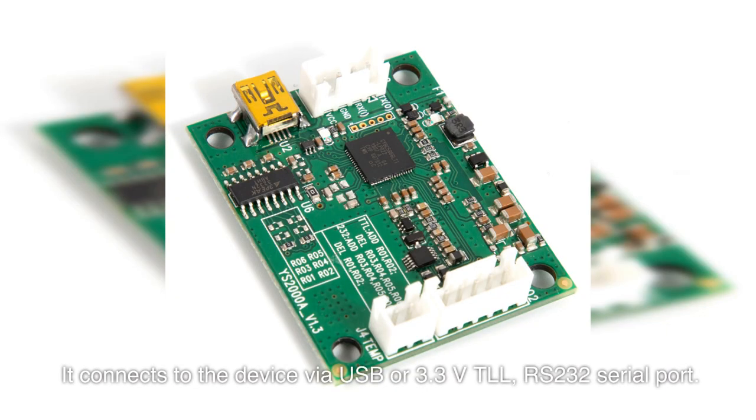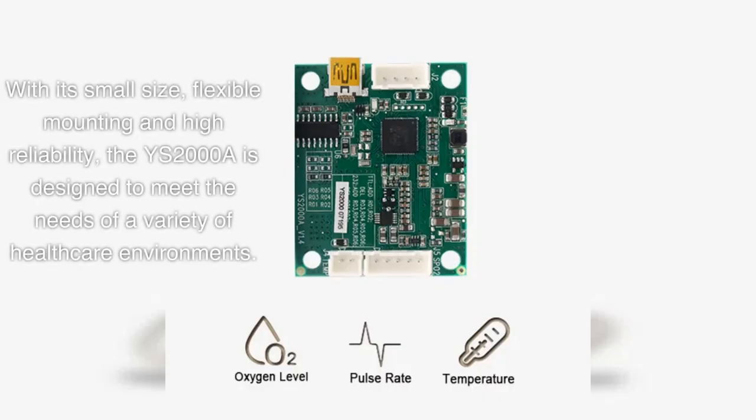It connects to the device via USB or 3.3V TTL RS232 serial port. With its small size, flexible mounting, and high reliability, the YS2000A is designed to meet the needs of a variety of healthcare environments.